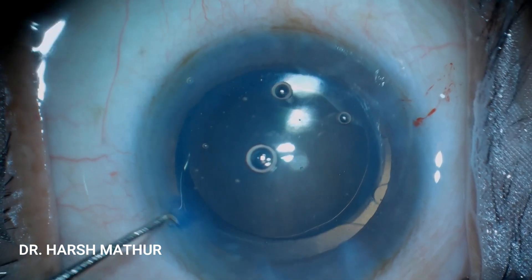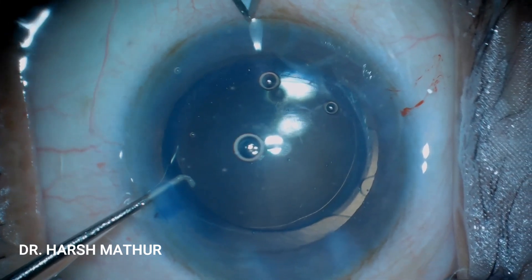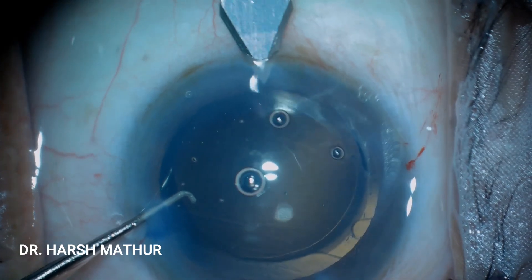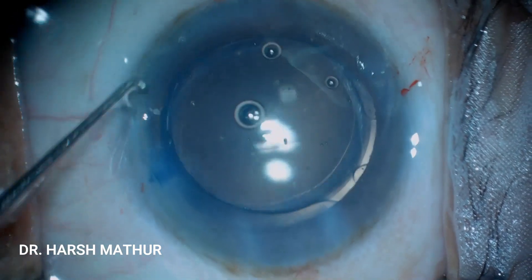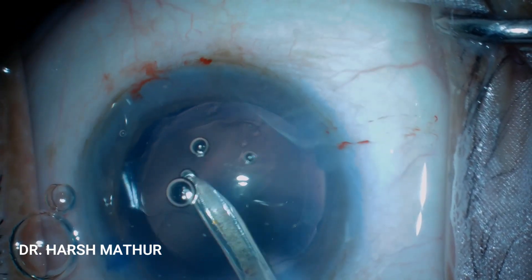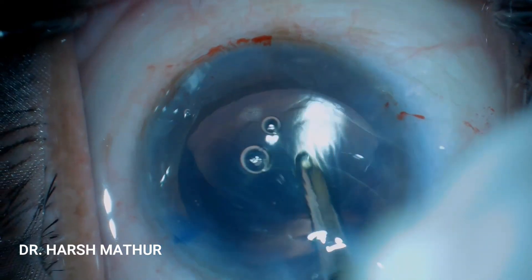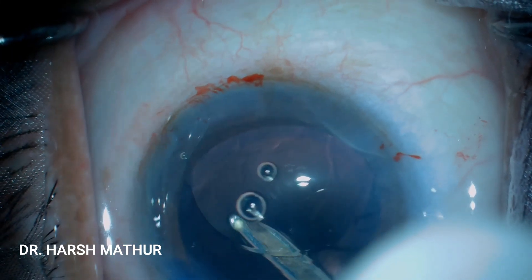The same 2.8 mm keratome is taken and the same tunnel is fashioned exactly opposite to the main wound. The viscoelastic can now be washed out and the patient can go home without patching the eye.